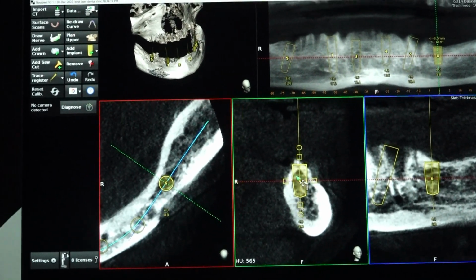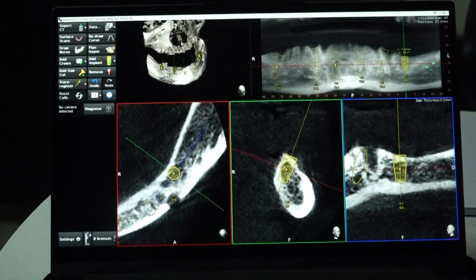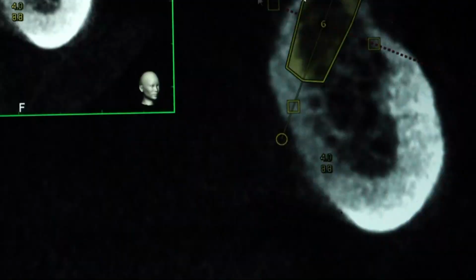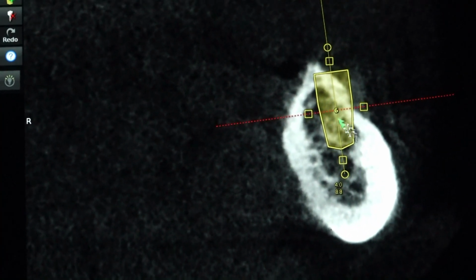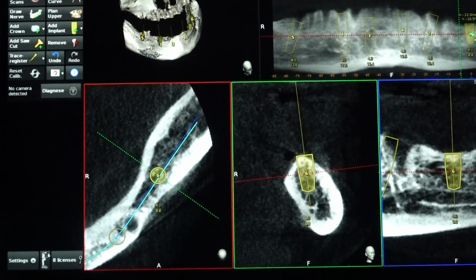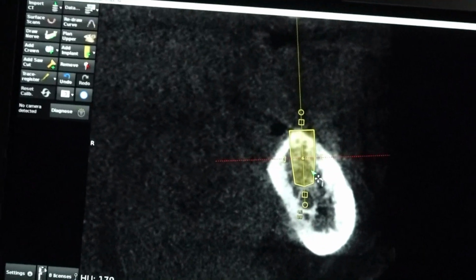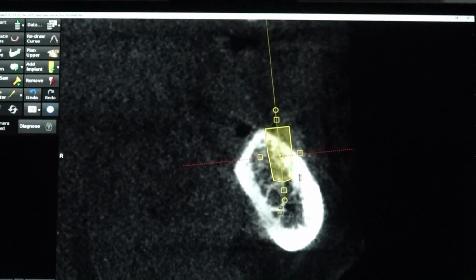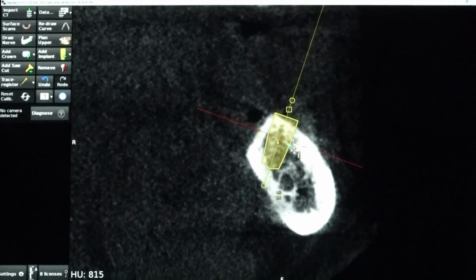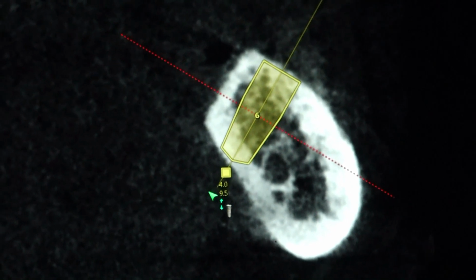When it comes to the left side, the situation is a little challenging because there is severe bone loss. I don't know where the nerve is, but it is very small, right? If you go slightly into the second molar, you will see the nerve. In the first molar area, the nerve disappears because of too much cancellous bone. So if you want to see the nerve, you check the 7 area. So this is the 7 area. You can try lingual cortical engagement beautifully here.